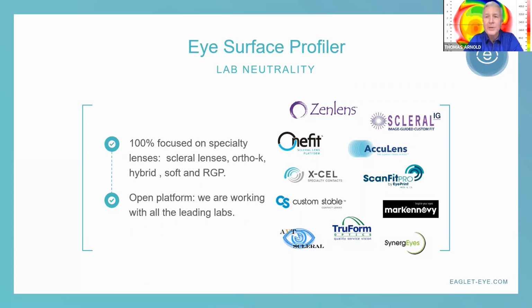So it's lab independent, lab agnostic, and there's more labs than these, although I know that these names are familiar to most everybody. So the chances are extremely good that whatever lab you're working with, whoever you use as consultants, you'll be able to still remain with them, and they will be happy to work with you on this, because the more data you can give to the lab and the lab consultants, the more accurate your fitting can be, and less returns, less remakes, and happier patients.